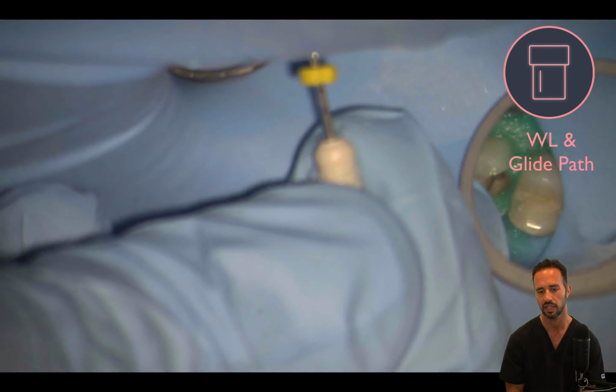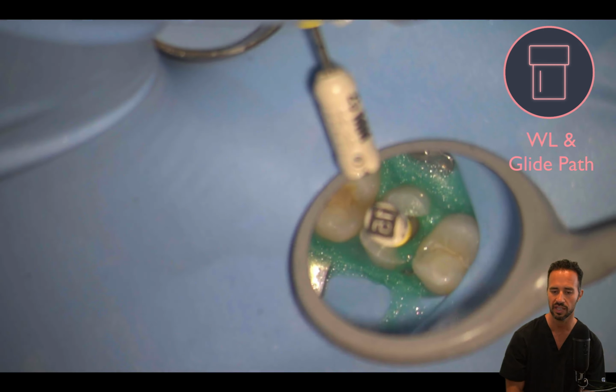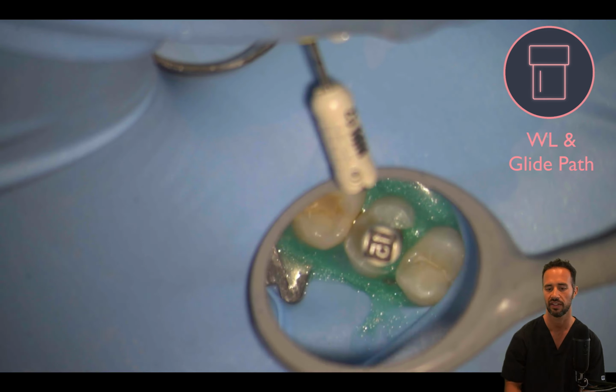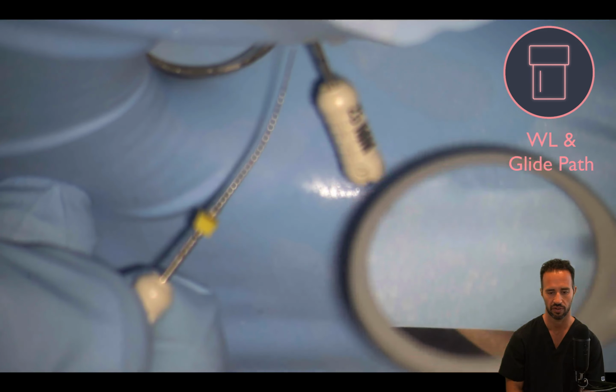And now I'm going to be going up to a size 15K file in each of the canals to 18.5 millimeters, our working length. And that goes pretty smooth in a case like this. And then we're going to introduce another 15 file into the palatal canal so that we can take our working length radiograph.